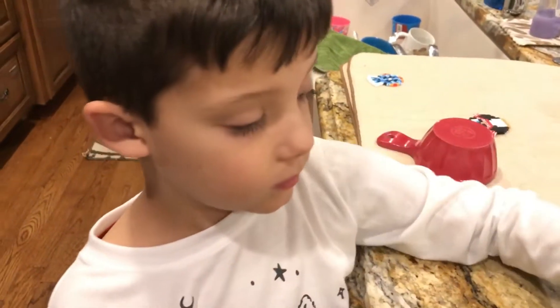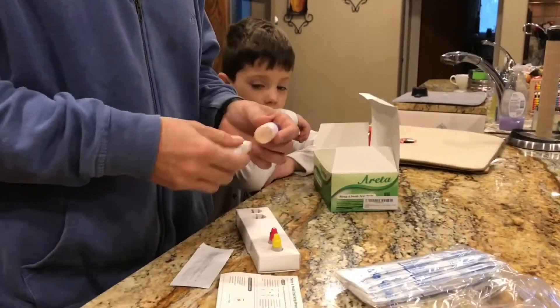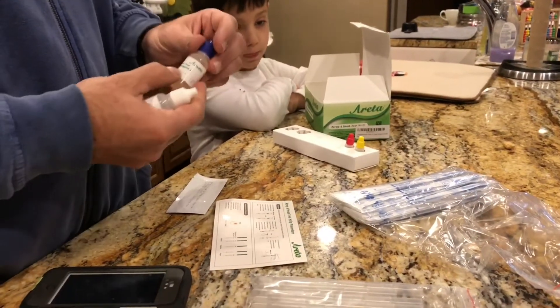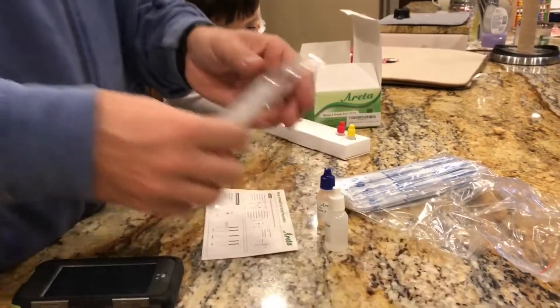Connor, you ready to show them how to do a strep test? Poor baby. So what we have here is reagent A and reagent B. You've got these little containers.